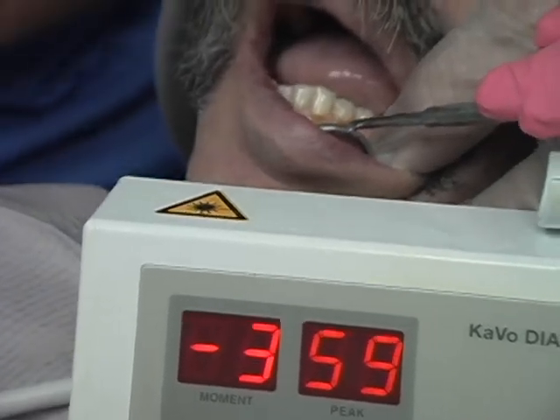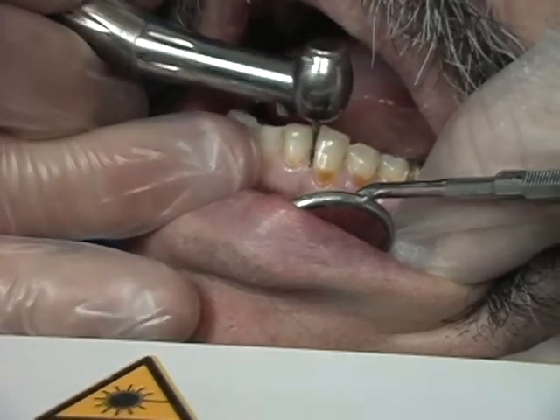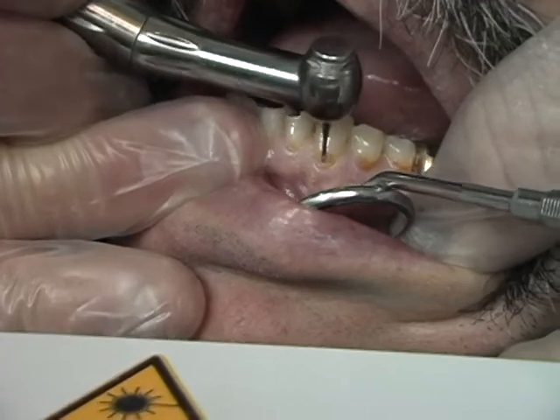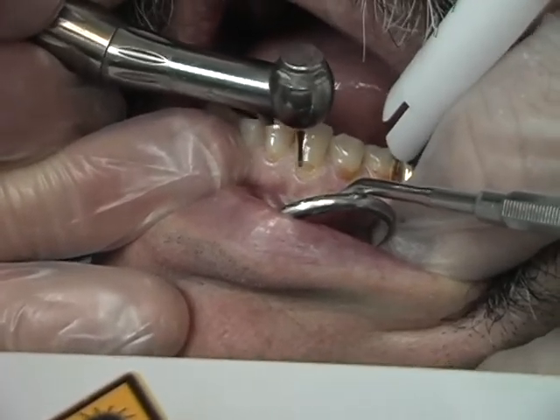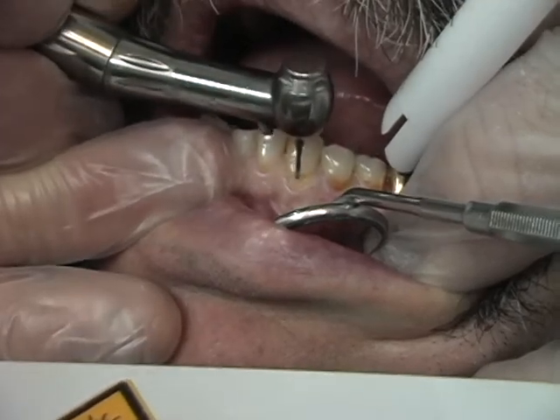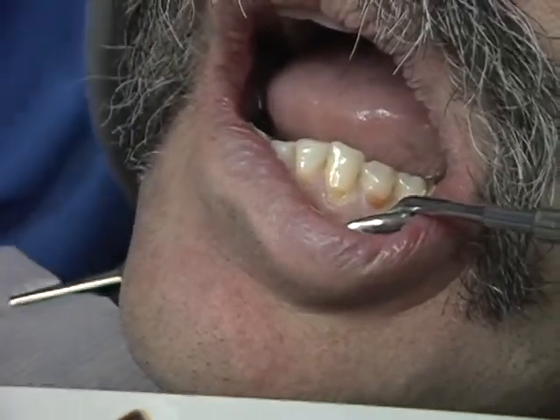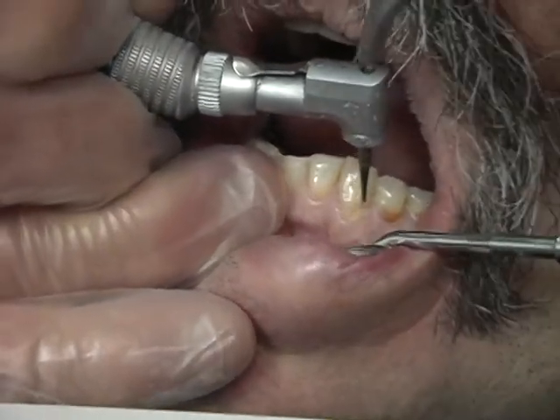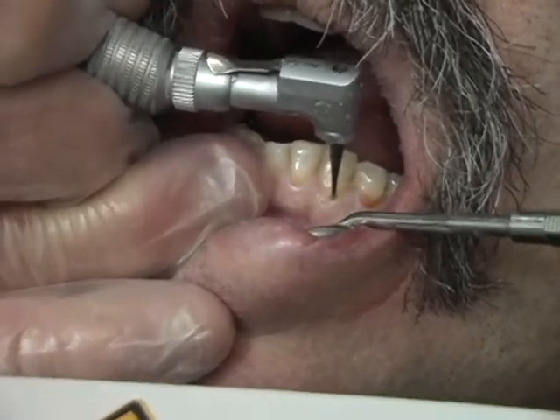We're going to move this away and we're going to come in with a high speed and we're going to take out some of this decay. When we get in here, we're going to come in with a slow speed handpiece and we're going to use the sense of feel to be sure we have the soft material out of here.